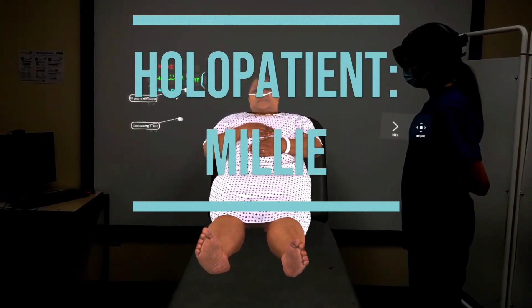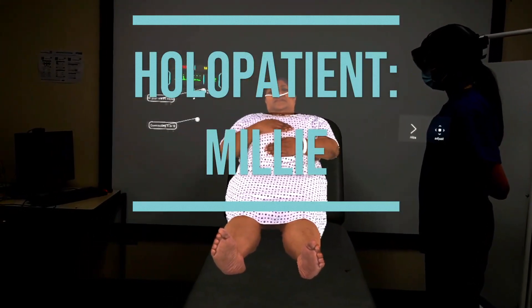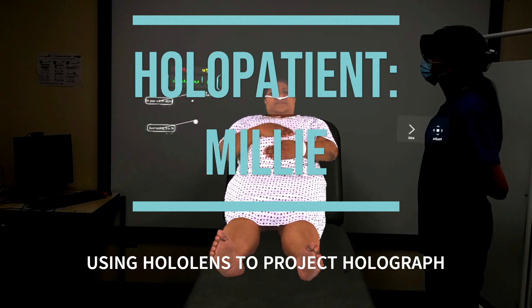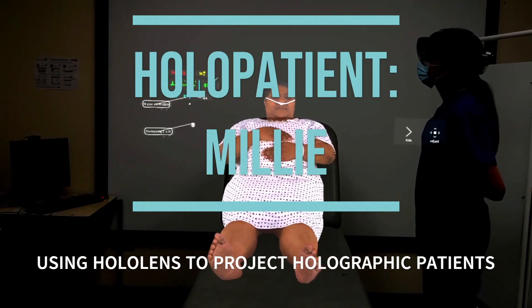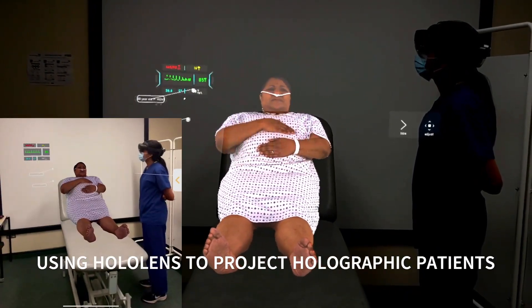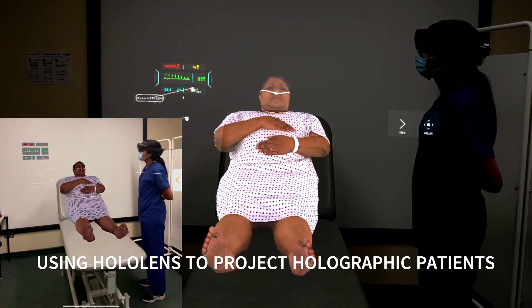This is a short video to demonstrate the use of the Holo patient as a function of the HoloLens as an educational tool in both undergraduate and postgraduate training.